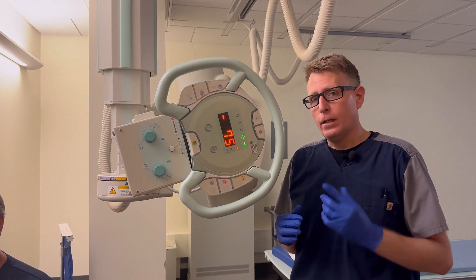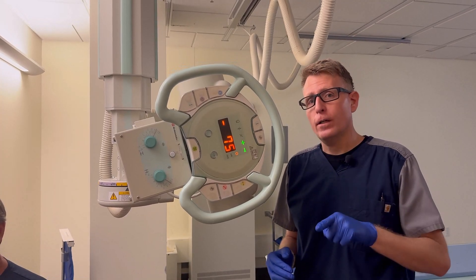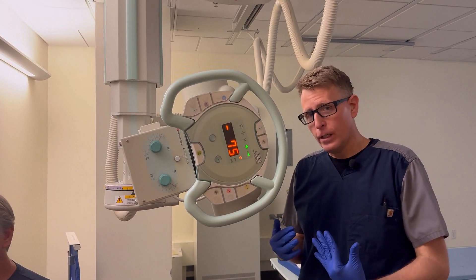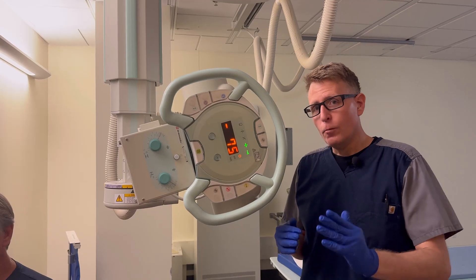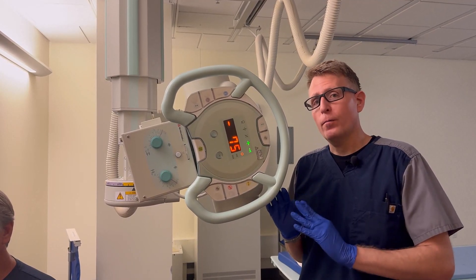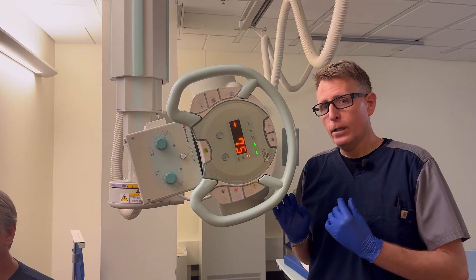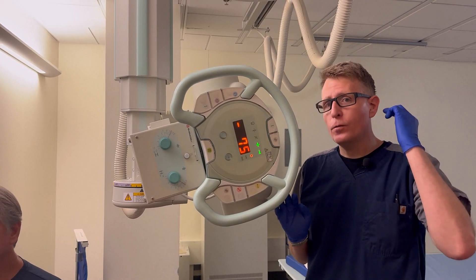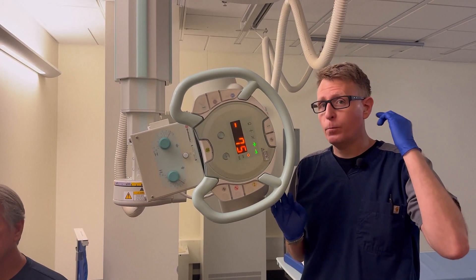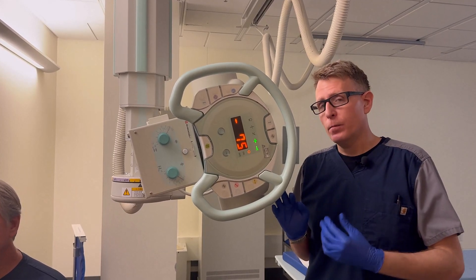The TMJ sits about a half an inch in front of the EAM. So if we're turning 15 degrees, we should be about an inch and a half back from that upside joint. It's not one and a half inches behind the EAM — that's putting it too far. It's about an inch behind the EAM.